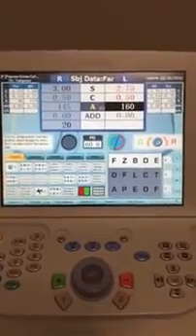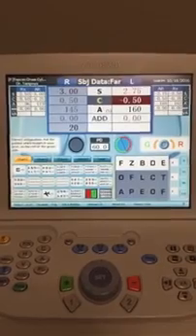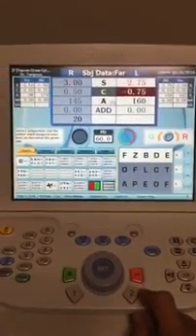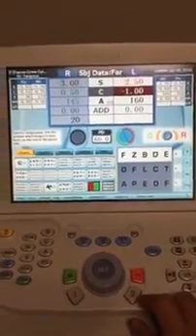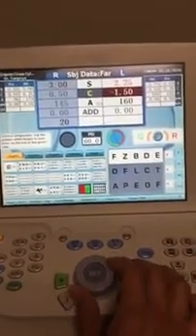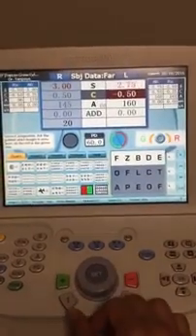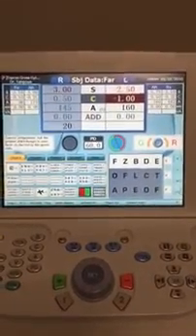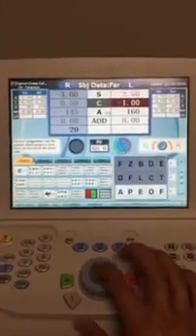I press set, it'll move to the cylinder, and I say which one's clearer. They say red side, so I hit red, and then they say red again, for example, increases in the cylinder, and as you can see, when it increases the cylinder, the system will automatically bring down the sphere. Like that, so you can see there. And that's where we started, came here. Now, you ask them, okay, which side is more clear? They say it's about the same. Okay, we'll stop it right there.